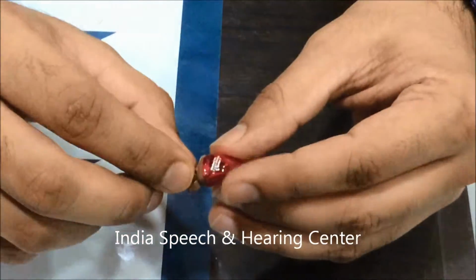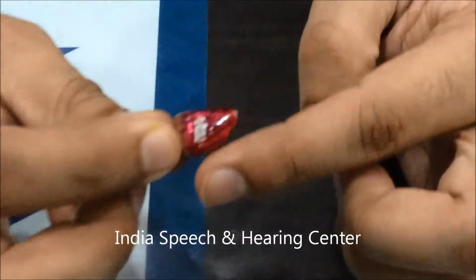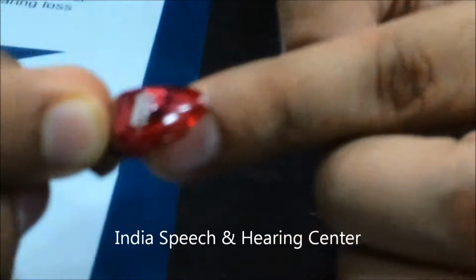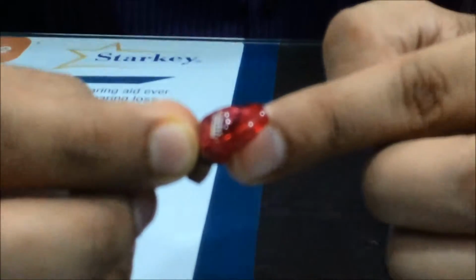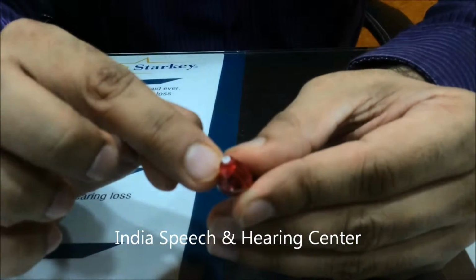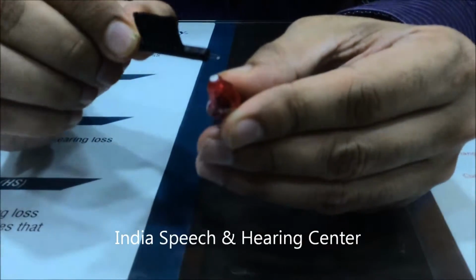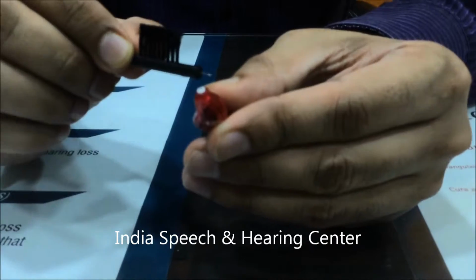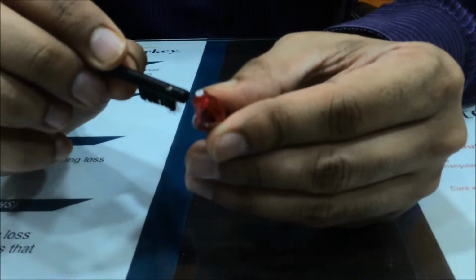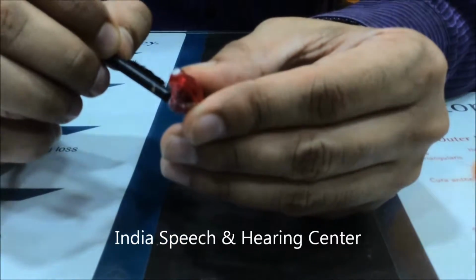The hearing aid has to be protected from water at all times, and the outer part or the shell of the hearing aid has to be cleaned regularly, either with a clean cloth or a dry tissue. The open end of the hearing aid has got a filter or the wax guard. This wax guard will be blocked eventually with regular usage. It prevents the earwax from entering inside the hearing aid and spoiling the receiver. Once this wax guard is blocked, it has to be cleaned or it has to be replaced.